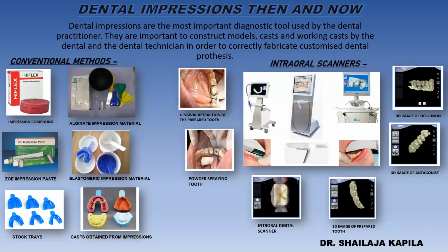With the advent of computer-aided design and computer-aided manufacturing being applied in the field of prosthodontics, a concept of intraoral digital impressions was put forward in the early 1980s. It has drawn comprehensive attention from dentists and has been used for dental prosthesis fabrication in a number of cases. This new digital impression technique is expected to bring about absolute digitization to the mode of prosthodontics.